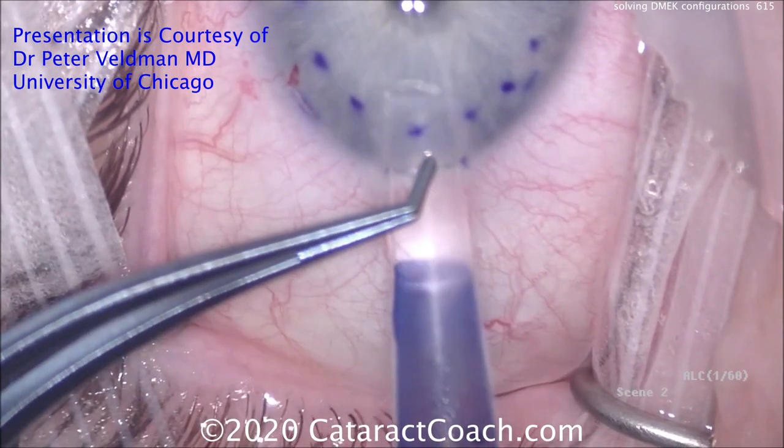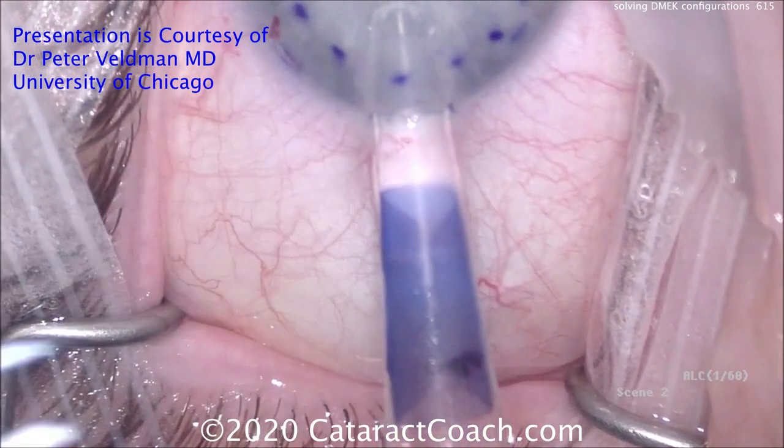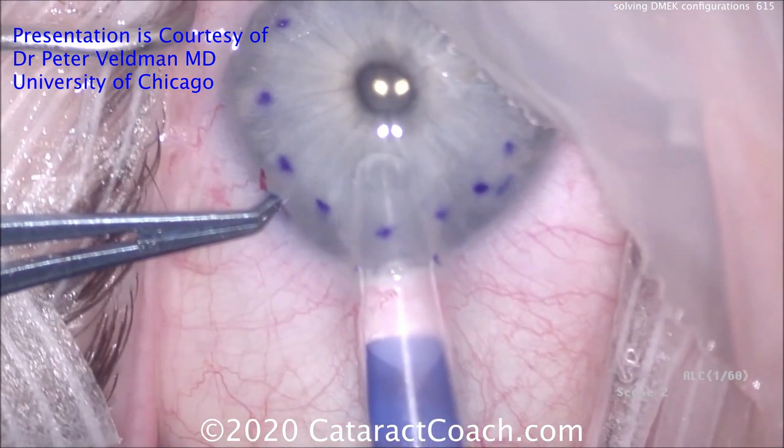This is a great video. You have to learn from Dr. Veldman. Watch this.